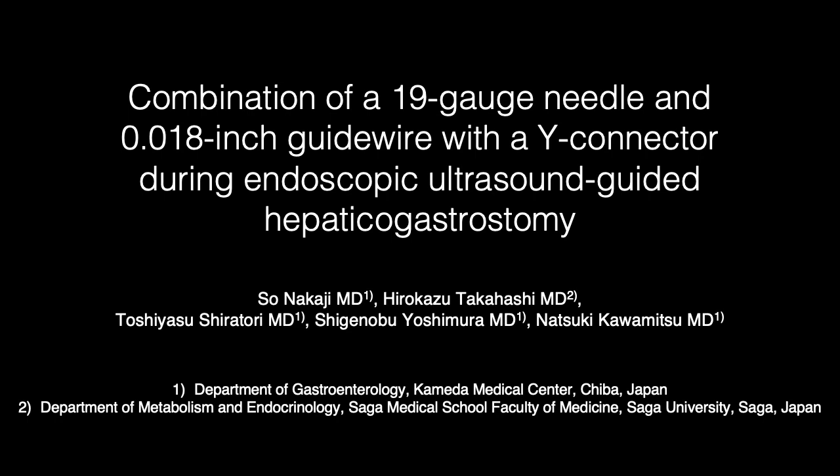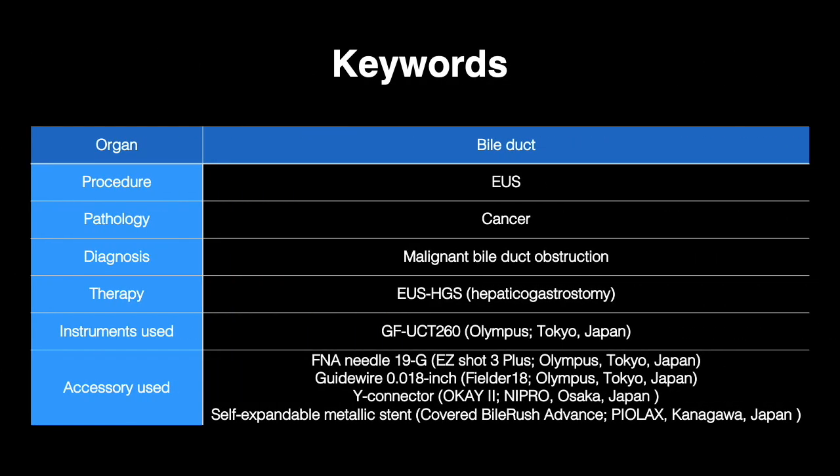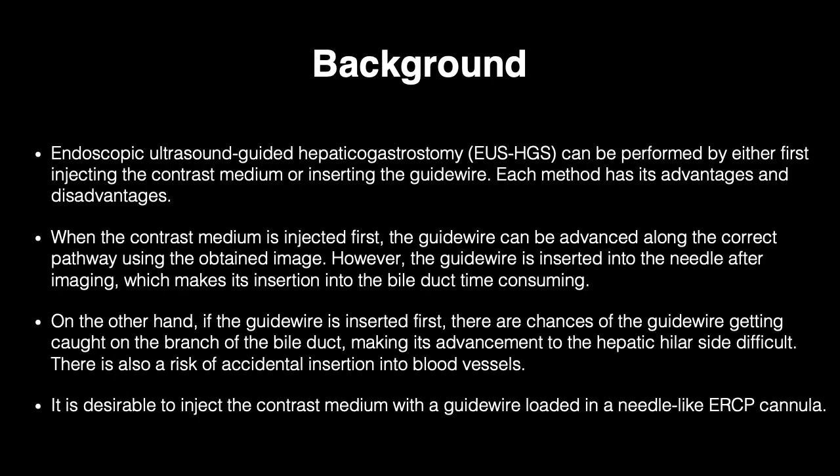Combination of a 19-gauge needle and 0.018-inch guide wire with a Y connector during endoscopic ultrasound-guided hepaticogastrostomy. EUS-guided hepaticogastrostomy can be performed by either first injecting the contrast medium or inserting the guide wire. Each method has its advantages and disadvantages.